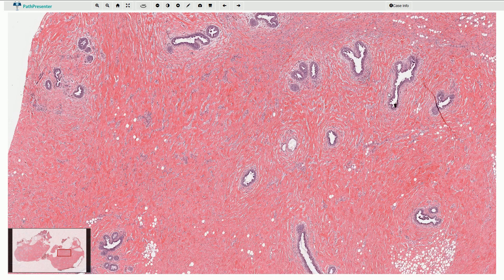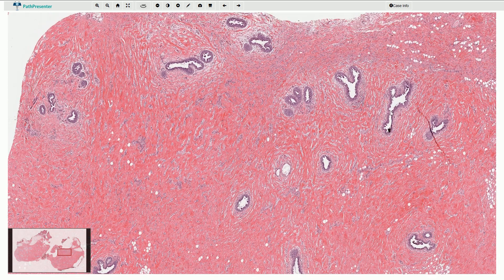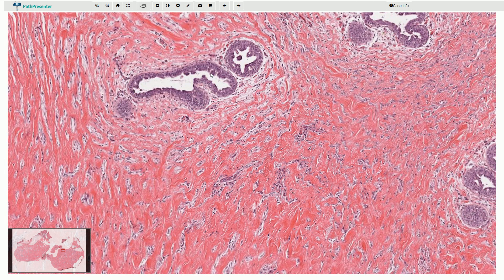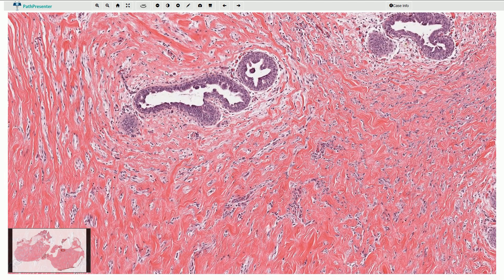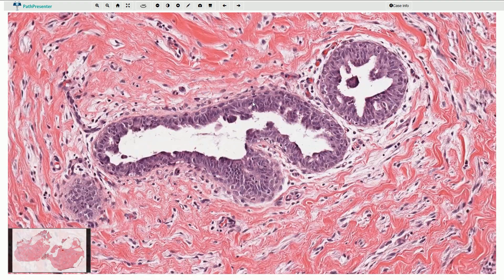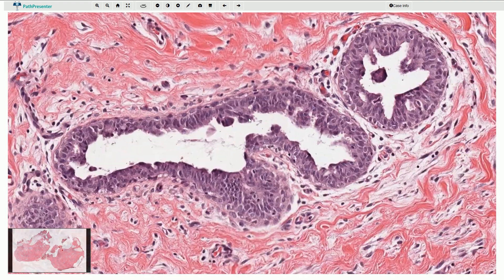Most of these ducts are associated with both epithelial and stromal proliferation. We see this papillary epithelial tufting and also proliferation of slightly myxoid stroma around the ducts. There is more than one layer of epithelial cells, and the epithelial hyperplasia can be quite florid — we typically see these finger-like papillary projections.